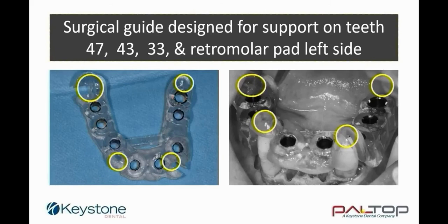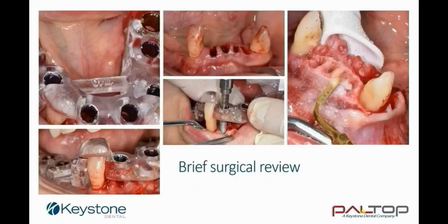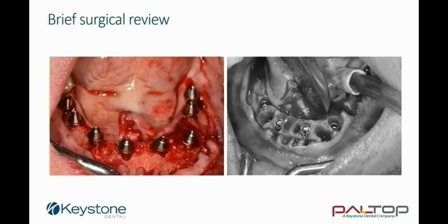The surgical guide is complete, and as specified before, it will have 4 points of support. The surgical guide was very stable during use. The anterior implants were planned taking into consideration that there would be some bone reduction in the anterior segment. The use of the surgical instruments through the surgical guide was made simple by having clear visibility. Even the placement of the implant could be viewed during the process.